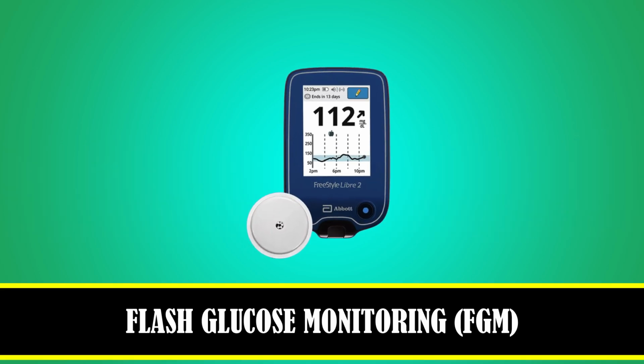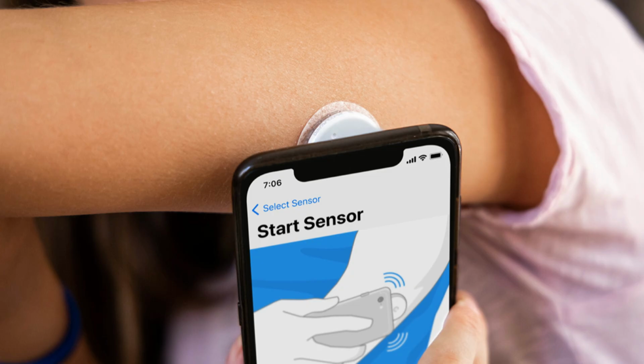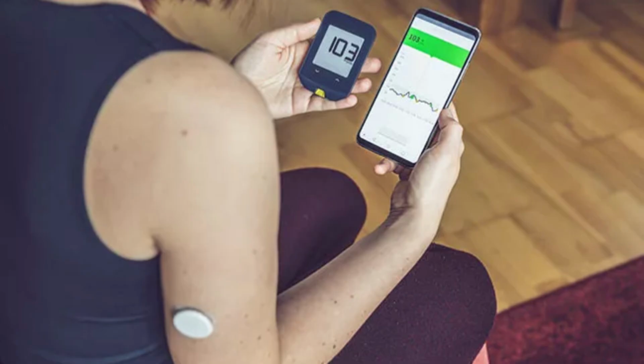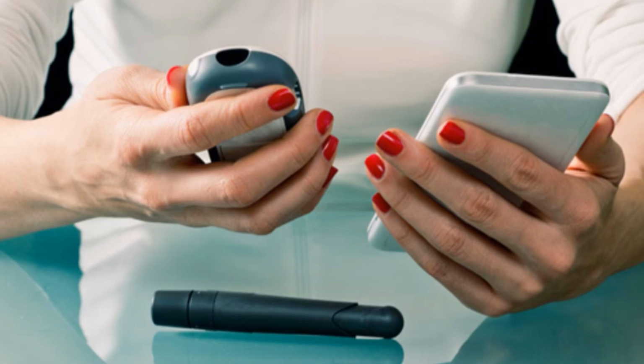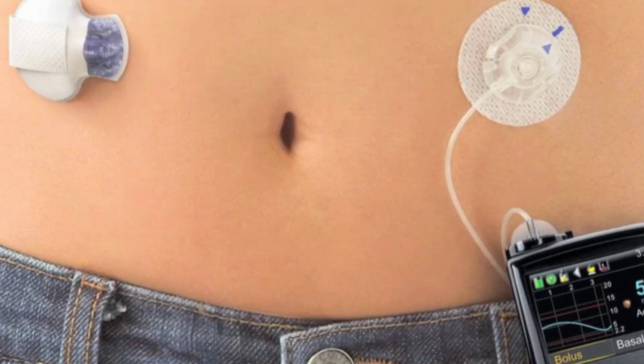With the flash glucose monitor, the sensor is applied to the side of the arm and you have to scan your smartphone or reader over the sensor to get your blood sugar readings. So the advantage of the CGM over the flash is that you do not have to worry about remembering or physically bringing out your device to scan the sensor, and if you use an insulin pump, there are some CGMs that can send readings to the insulin pump.